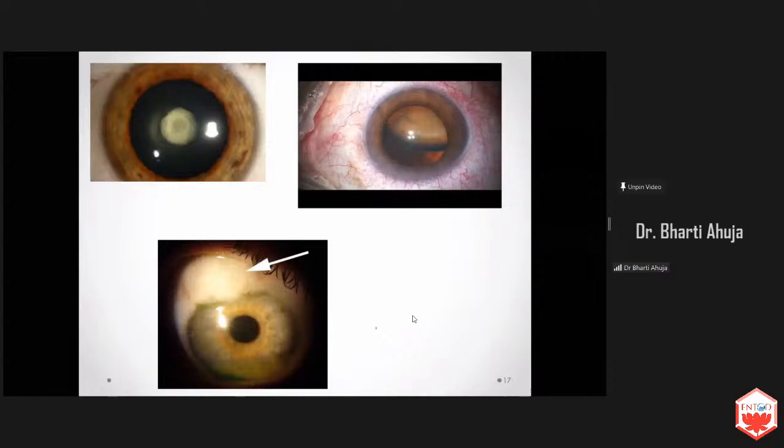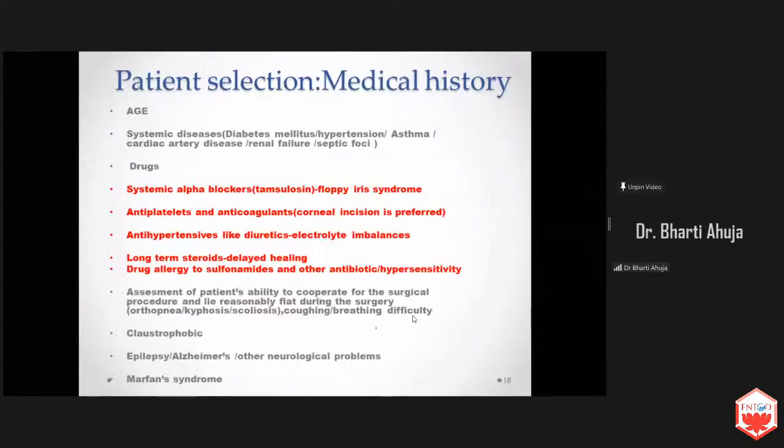Pupillary dilatation, again. Posterior polar cataracts: it's a no for hydrodissection because of obvious PC dehiscence, or sometimes the PC is very thin. The risk of posterior capsular rent is more in these eyes. Zonular status is to be ascertained in cases where there is lens subluxation. In eyes where there is a previous trab done or a presence of bleb, again we have to decide about the type of incision and site of incision, and these eyes generally are hypotonous, so there is difficulty in tunnel dissection also.